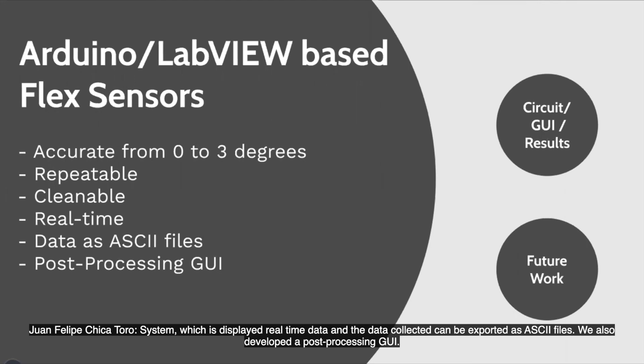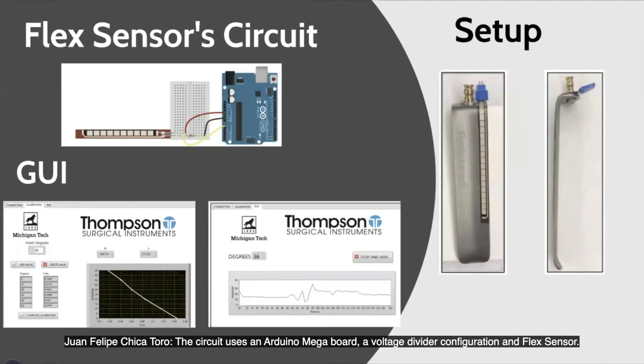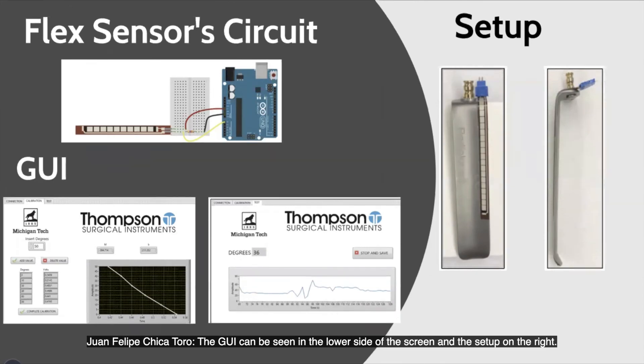The circuit used an Arduino Mega board, a voltage divider configuration, and a flex sensor. The GUI can be seen on the lower side of the screen and the setup on the right.